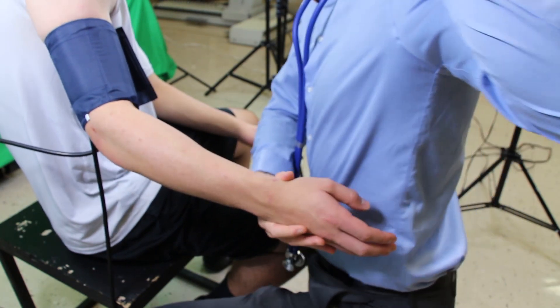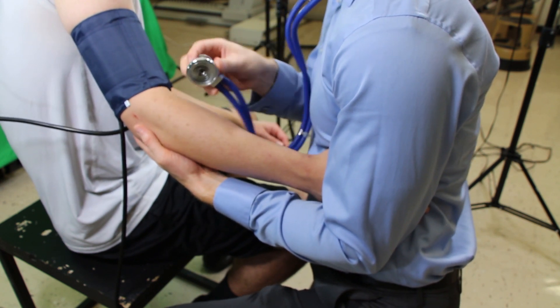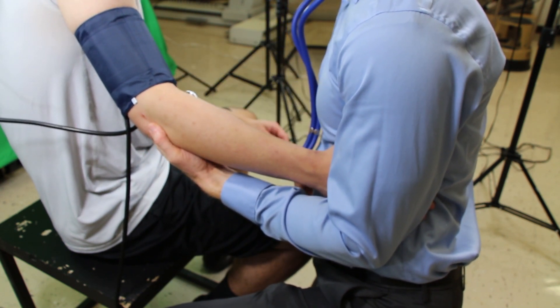Throughout the blood pressure measurement, make sure you are supporting the person's arm. Hold their elbow with one hand and tuck their hand between your arm and your side so you are completely supporting both the lower and upper arm. You don't want the person to hold their own arm up, as it will artificially increase their blood pressure. If you shake your hand and their arm moves with it, you're holding it correctly.